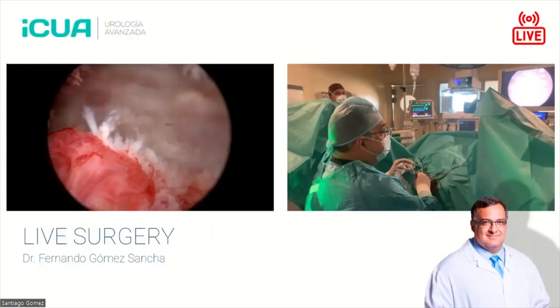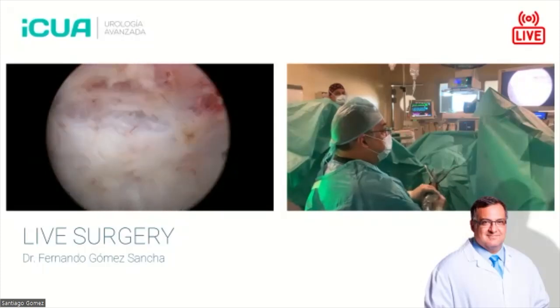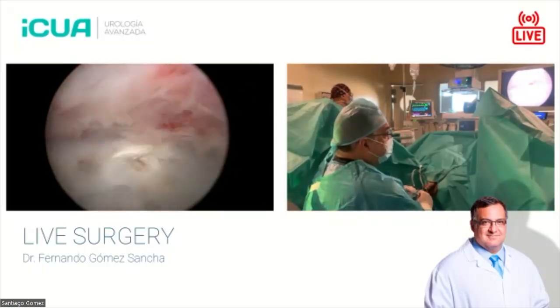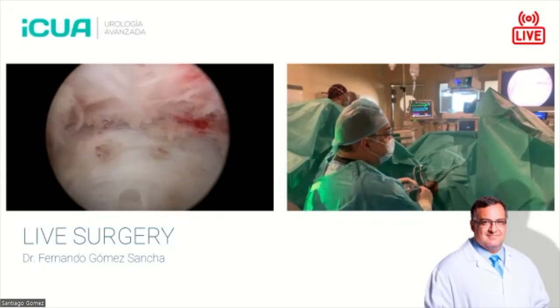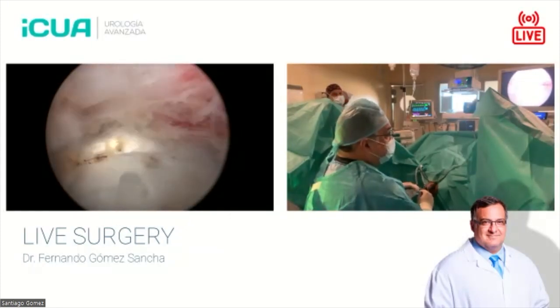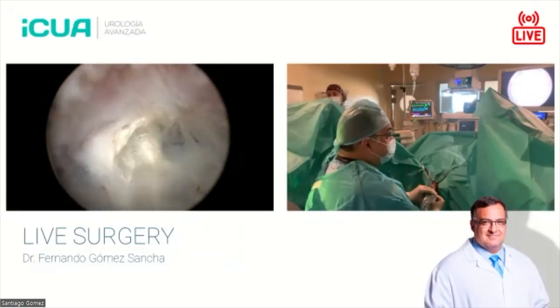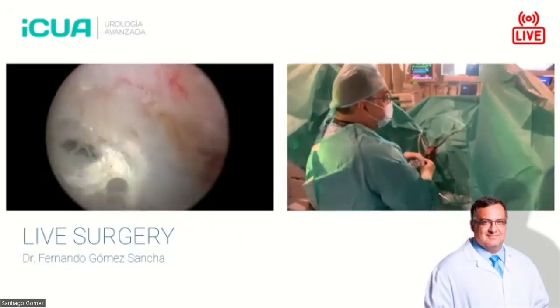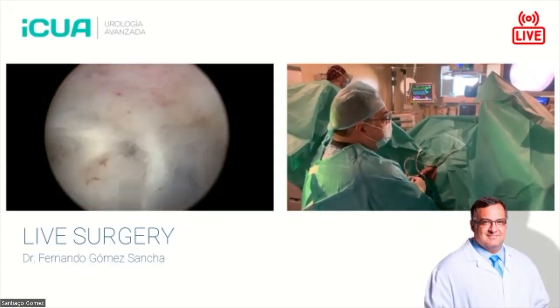Okay. So we take it from the same point where we left it. This is the posterior line we are developing. And I will develop this line. And as I said, if you work, for example, too far, there's no effect. If you get slightly closer, there will be some coagulation effect, but there's hardly any dissection. If you get even closer, then you start seeing that the energy is disrupting the fibers that connect the capsule and the adenoma. So working distance is paramount.